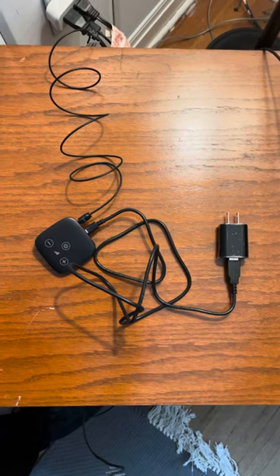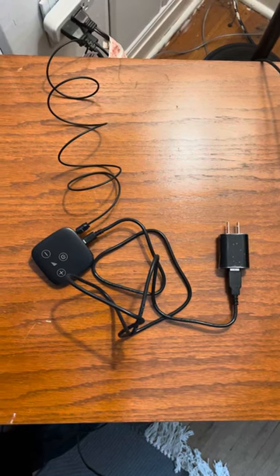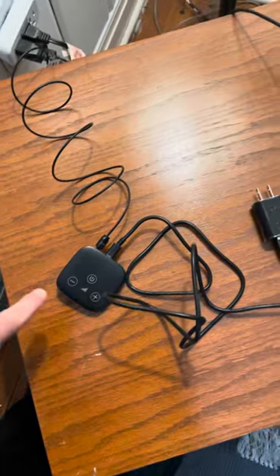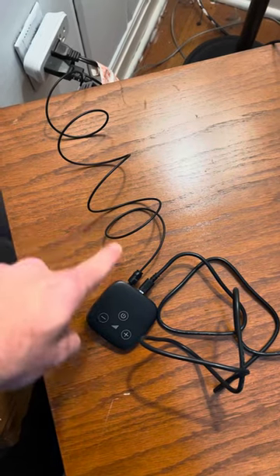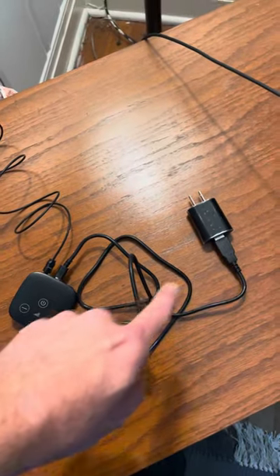In this video I'm going to show you how to connect a Phonak TV adapter or TV connector to a standard television. As you can see here the TV connector is on the table. On this end, this trailing wire is the digital audio out connection, and then this wire right here is the power connection.